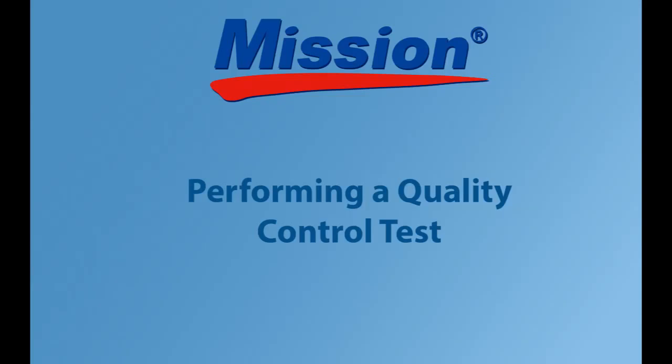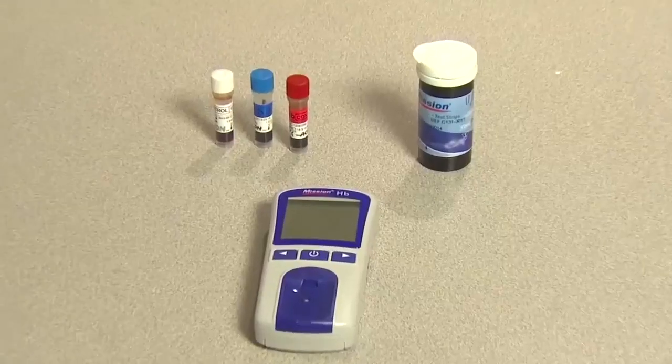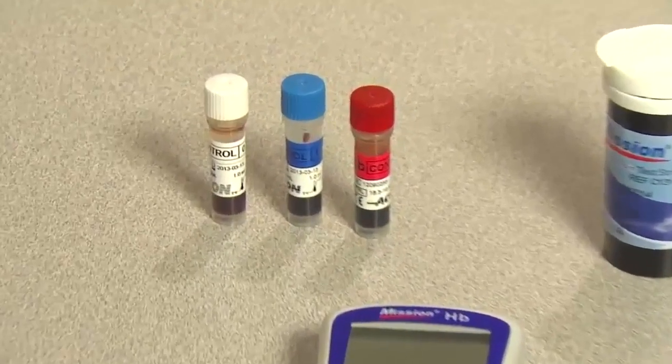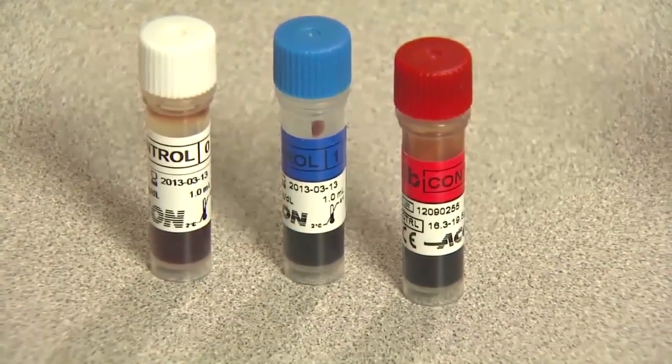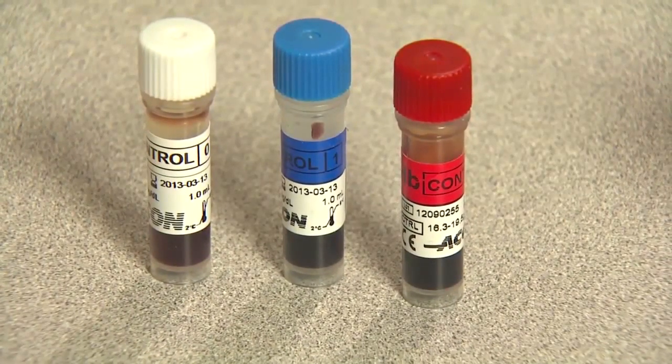Performing a quality control test. A quality control test is performed to ensure that the test strips and the meter are working together properly and that you are performing the test correctly. Mission HB Hemoglobin Control Solution testing is performed in a very similar manner to blood tests, using the Mission HB Hemoglobin Control Solutions instead of blood.